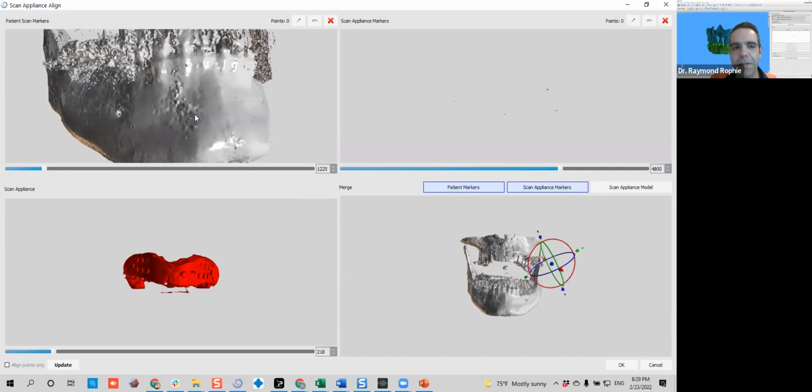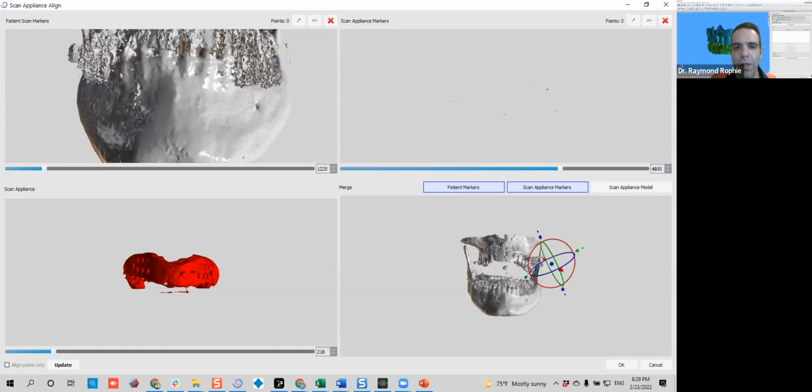And the way to bypass this is that if you're working only on one side, make sure that that side is perfectly aligned, and that the error that will yield that CBCT error is on the contralateral side, right? And if you're working in both sides, then what you do is you duplicate your model and you align one in one side and then the other side, and you make two guides for this. Okay, that's the actual way of bypassing these issues. Okay, so any other one? Yeah, let's go on. Good.